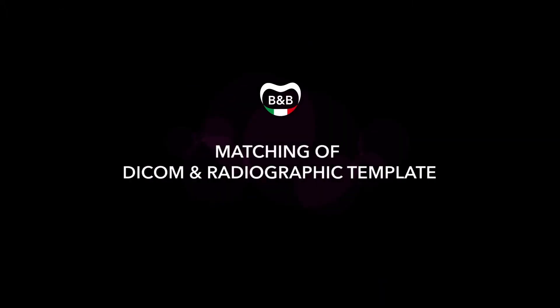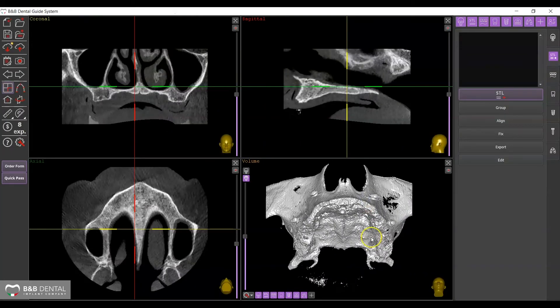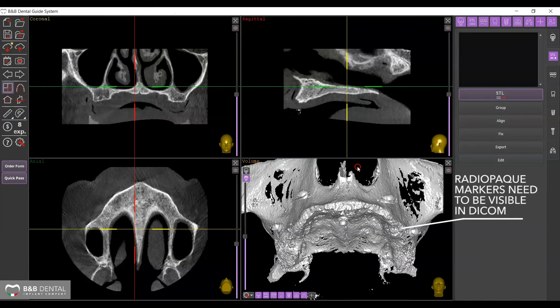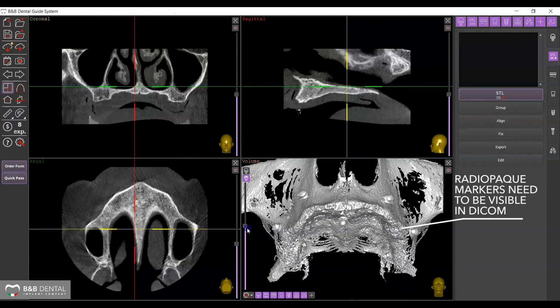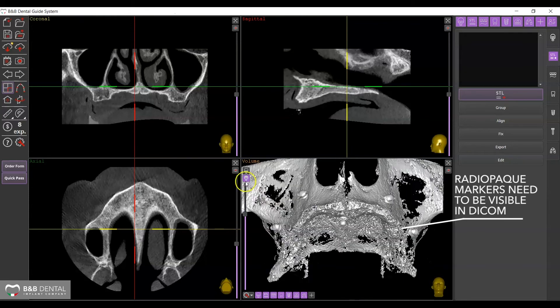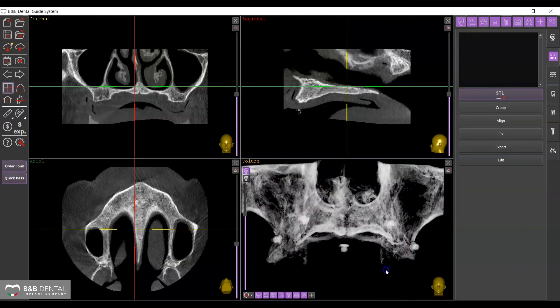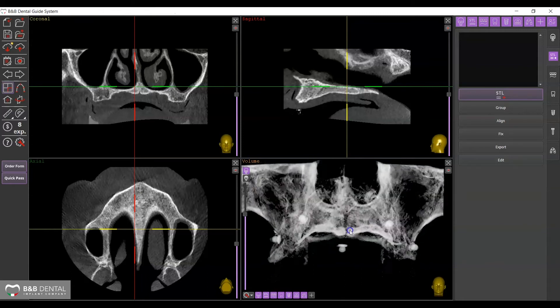Import the DICOM file. In this case, it must have been obtained by using the radiological template and radiopaque markers in the patient's mouth. The presence of radiopaque markers and their uniform distribution throughout the arch is important to provide an improved matching of the two files in all areas.